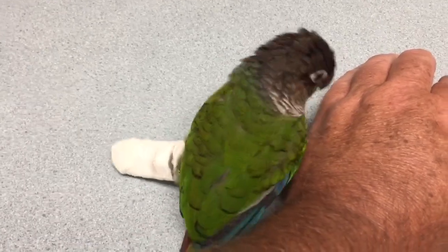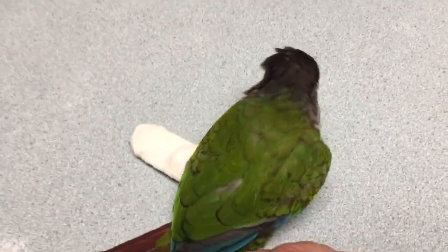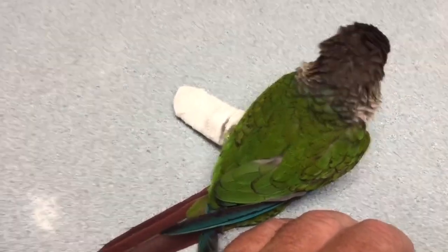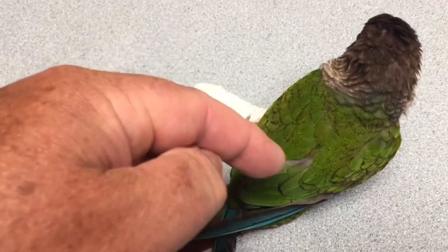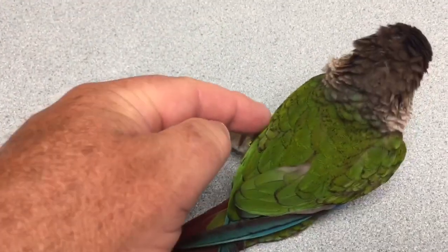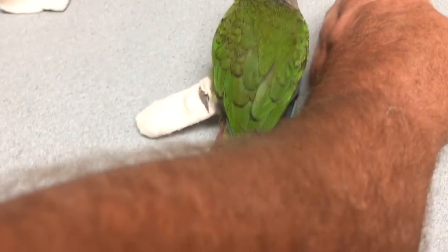Well, here we are. It is now post-procedure. This bird only yelled at me once, so obviously we're on the right track. This is the Philip Thomas extension splint. As I described, it goes around the hip there, the leg comes through the ring. There's a guard bar here and a guard bar here, so if he starts trying to chew at it, it makes it difficult for him to get to his leg.